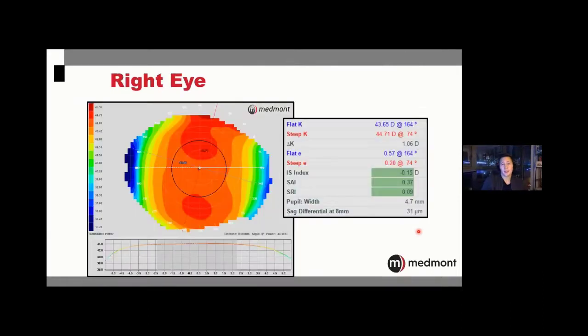And we might take our corneal topography, and what would we assess? Now, this is a patient that's an adult, but let's assume if this were myopia control in kids, all of these assessments that we're doing are exactly the same, whether it's for an adult or a child.